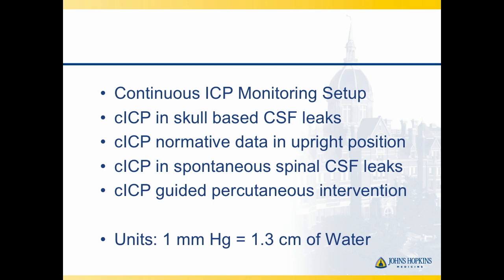Throughout the talk, you'll see this interconversion between the units, because when we do lumbar punctures, the units are always centimeters of water, but just because of tradition and convention, when you do ICP monitoring, the units are always going to be in millimeters of mercury, and there's an easy conversion from millimeters of mercury to centimeters of water.